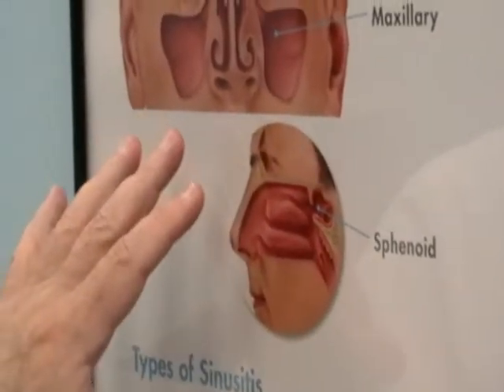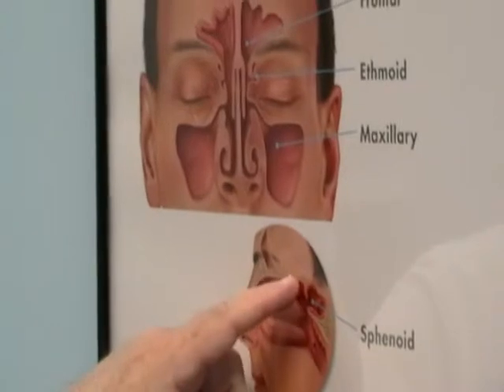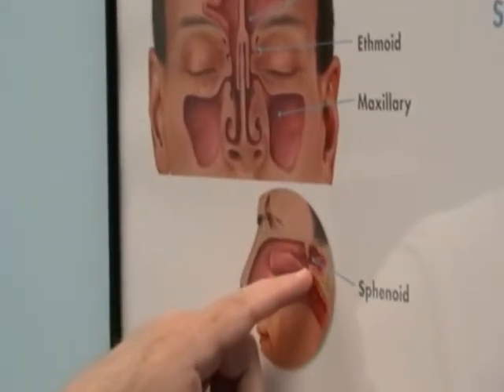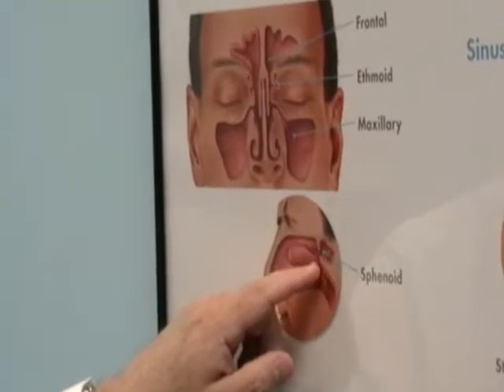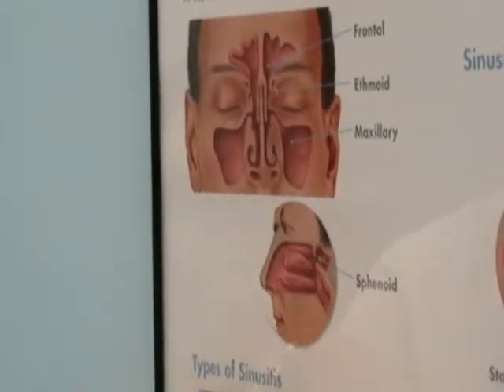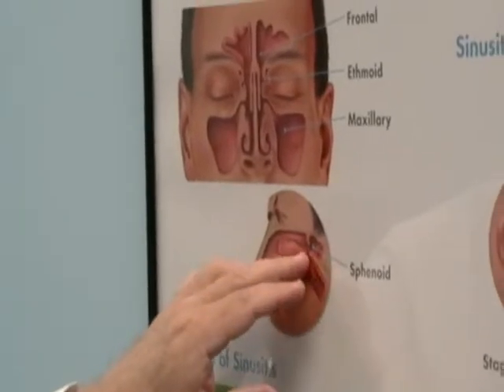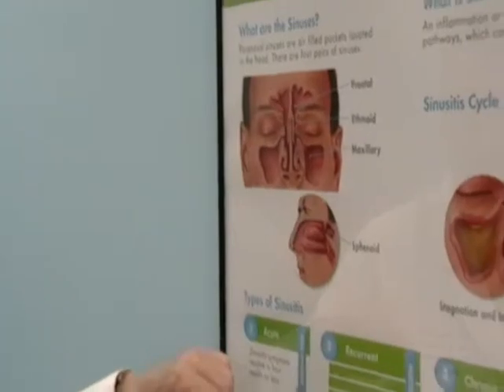Note that all of these sinuses, the frontals, maxillaries, and sphenoids, have an opening that's made of bone covered by a layer of something called mucosa. Mucosa lines all of our inside structures, whereas skin covers our outside structures. So we actually can pass a balloon into those openings and dilate them.